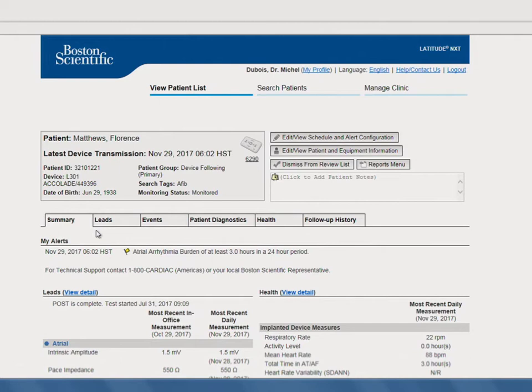Note that while dismissing a patient does remove them from the For Review filter on the View Patient List page, that patient data is still accessible from the All Patients filter, and their alert information is still available to you on the Follow Up History tab.